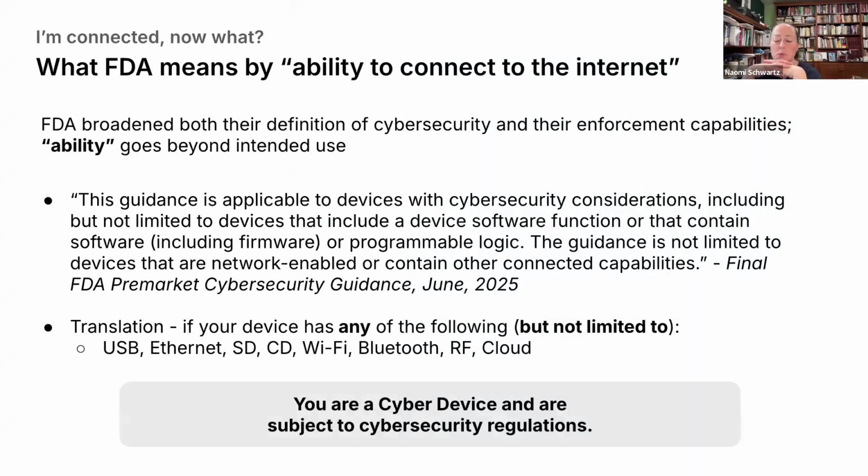Okay. So once you're connected, you have to consider what FDA means by that ability to connect to the internet, because there's been a lot of confusion about that, and a lot of manufacturers have really struggled to explain between the R&D teams and their quality and reg teams, what does this mean? I didn't intend for it to connect to the internet, but somebody found a way to make it do so. Well, you have the ability, right? That is unnecessarily complicating your life, but it's a fact. People can plug something into a USB port, and if they can find the right accesses, they can enable it to now communicate wirelessly through some kind of a dongle.